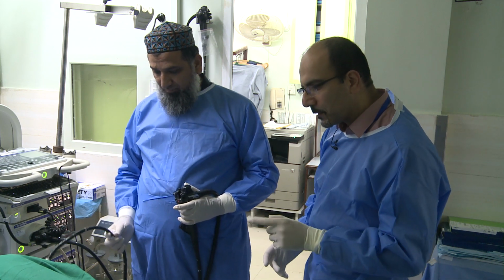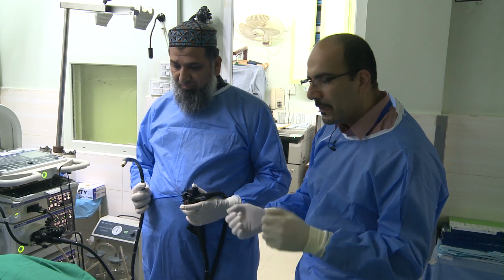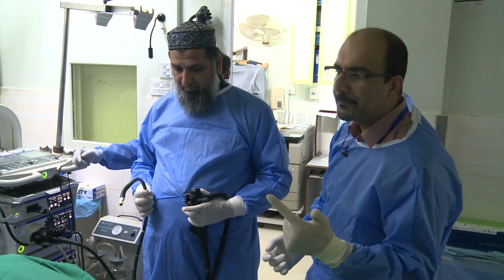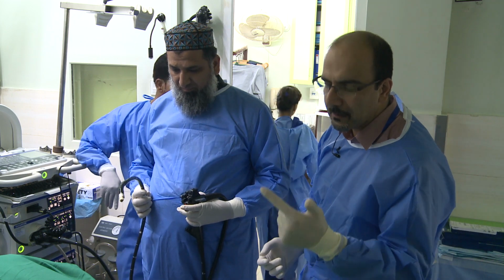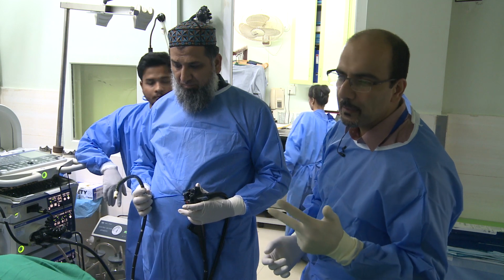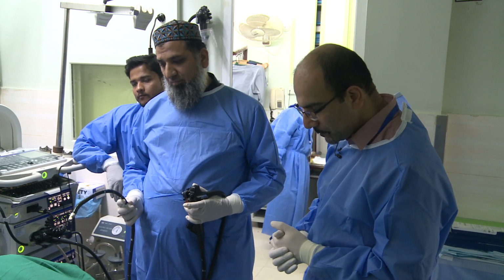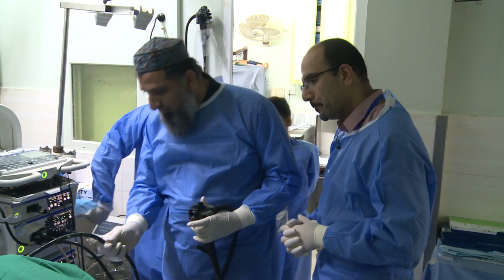And then what we discussed in terms of the learning objectives: passage of the echoendoscope safely into the esophagus and stomach, identifying the pancreas and other structures through the stomach, and hopefully also attempting to identify some structures from the duodenal bulb. And intubation by trainee, right? Yes, intubation by trainee. Good, thank you.